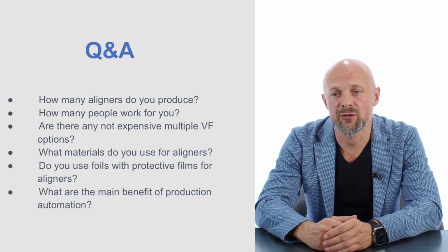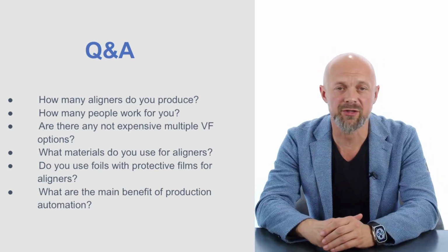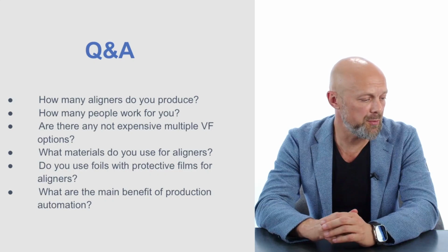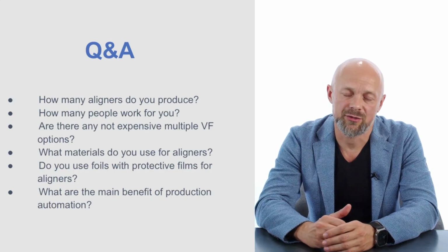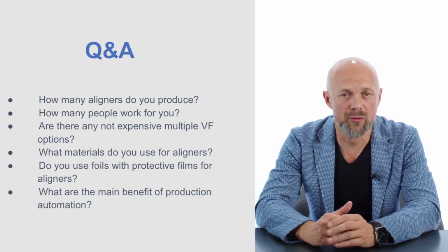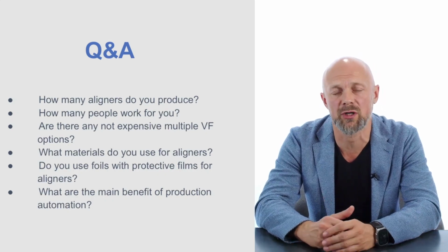Also, we tested a multiple vacuum form device from an Italian company. This is Bart Medical. They also manufacture a multiple vacuum form device called B Pro. With this device you can suck the same 9 aligners per one shot. One of the benefits of B Pro is that it can work with, let's say, standard round or square foils, 125 or 120 millimeters.